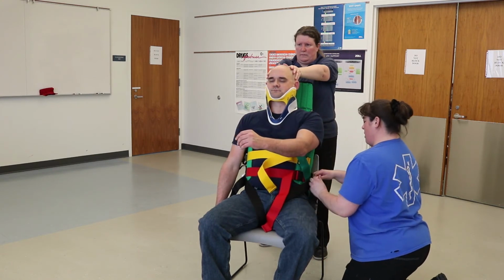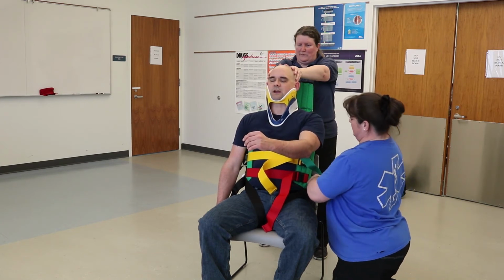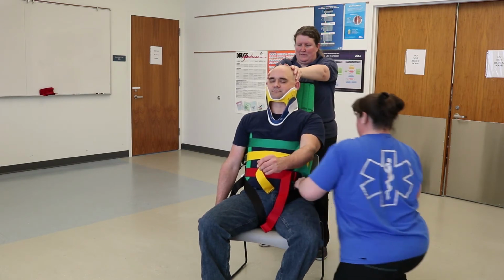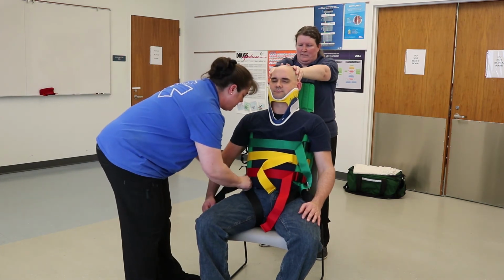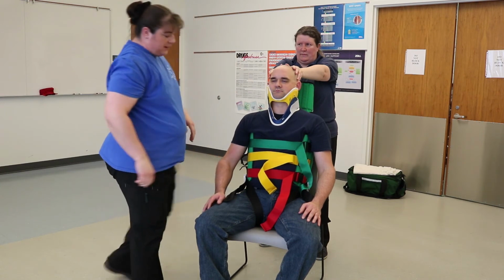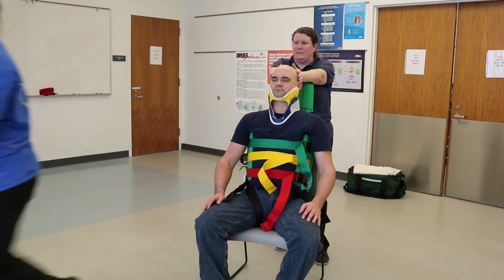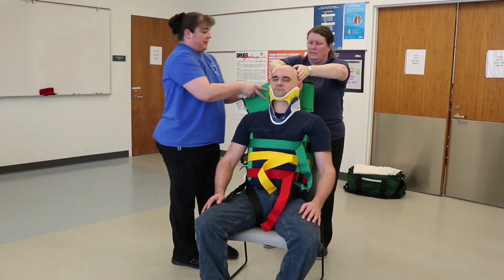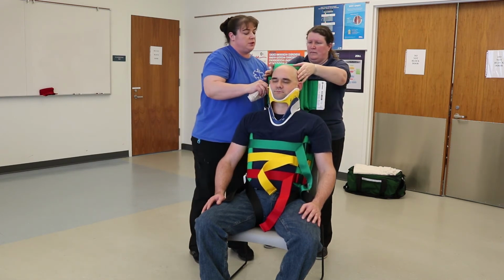Are any adjustments necessary? I don't think so. Okay. And I'll secure and tighten the hip straps. Okay. Now I'm going to measure and apply padding between the back of the head and the device, and ask my partner to continue to hold C-spine.